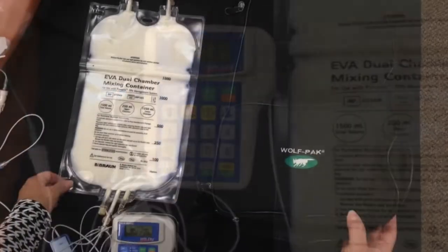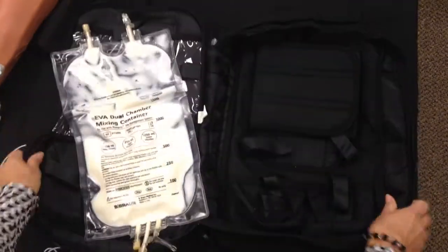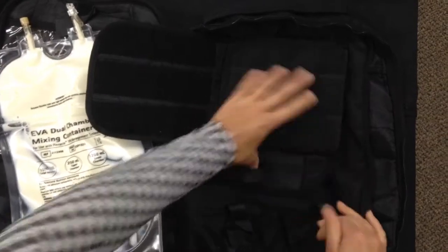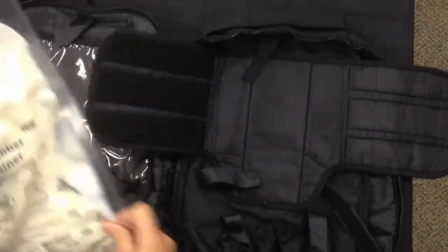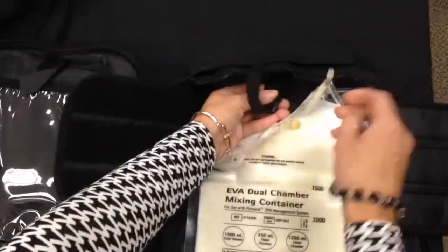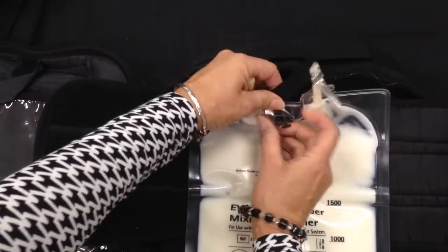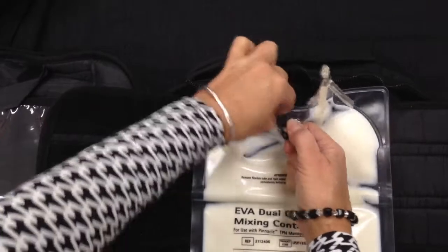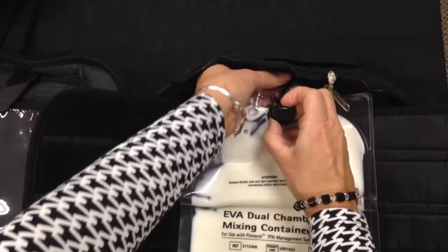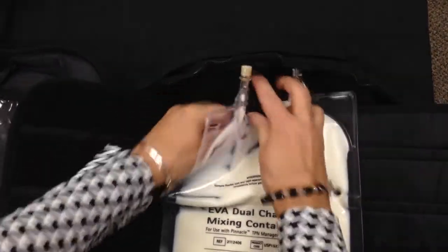Okay, we're ready to put your TPN in the backpack. Open up your bag. Open up the large Velcros. There is a clip that needs to feed through the top of the bag. There's a little hole for it right there. It will fit. It's a little tight. And then you want to clip the two ends together and pull the end tight.